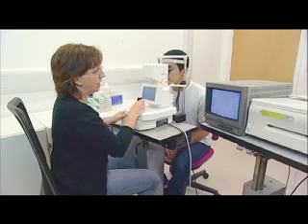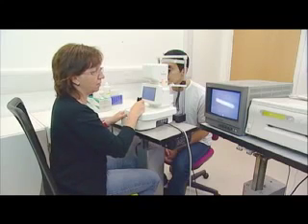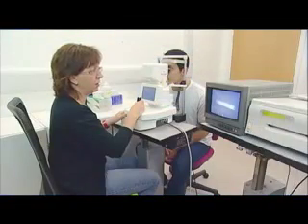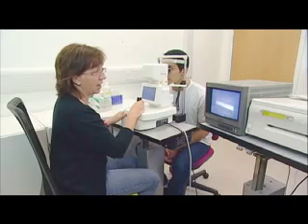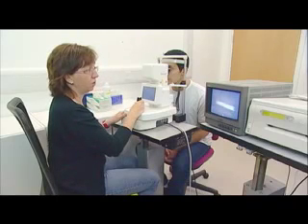On the monitor here, you can see these black and white stripes. The width of these stripes forms a direct relationship to the radius of curvature of the meniscus as it acts as a concave mirror. The broader the stripe, the greater the radius of curvature, and the greater that we would estimate the tear film volume to be.